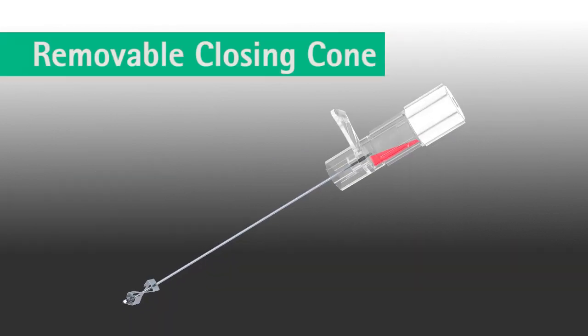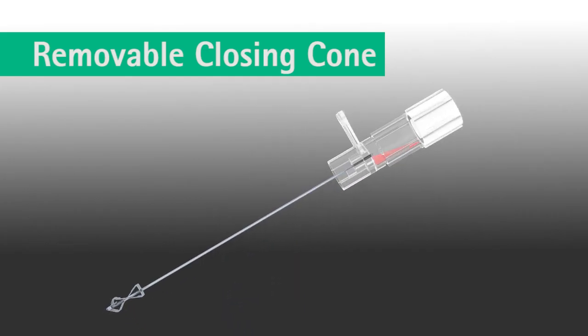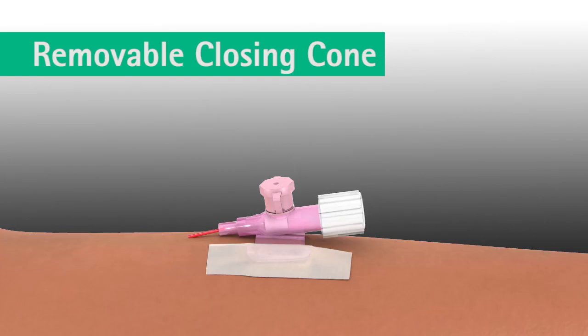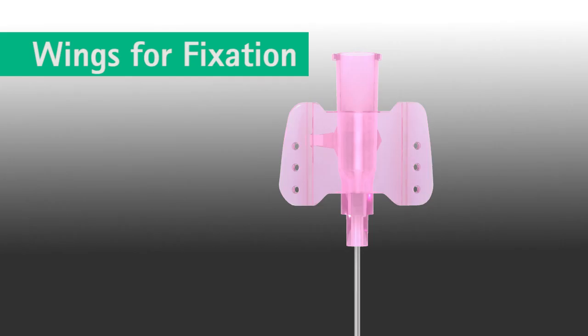The removable closing cone gives the user the possibility to close off the Varsafix safety IV catheter with one hand directly after catheter placement. Easy and stable fixation is granted via the size of the wings of the Varsafix safety IV catheter. The wings contain holes enabling air venting.